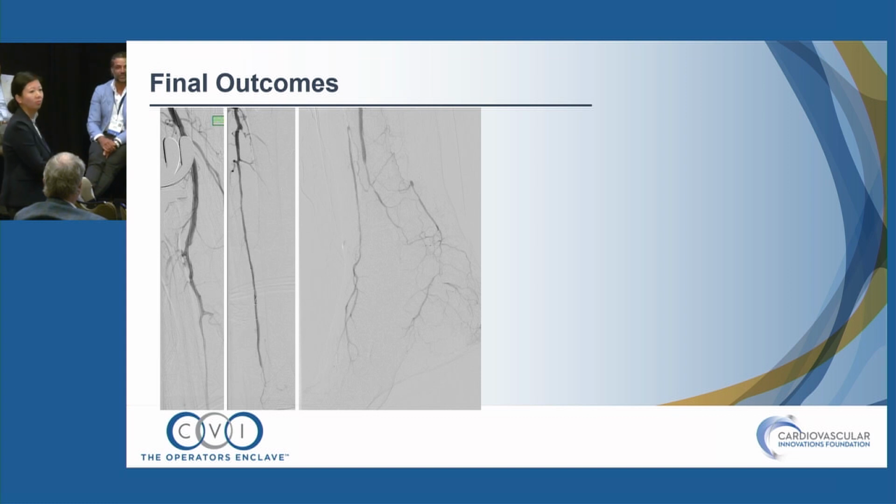Oozing from the skin, not extravasation on arteriogram, you mean? When you say oozing, do you mean arteriographic extravasation? It's an angiographic phenomenon. When you do that angiogram, you're also injecting with high force contrast, so it may look like an extravasation, but practically speaking, it's just an ooze underneath the skin.